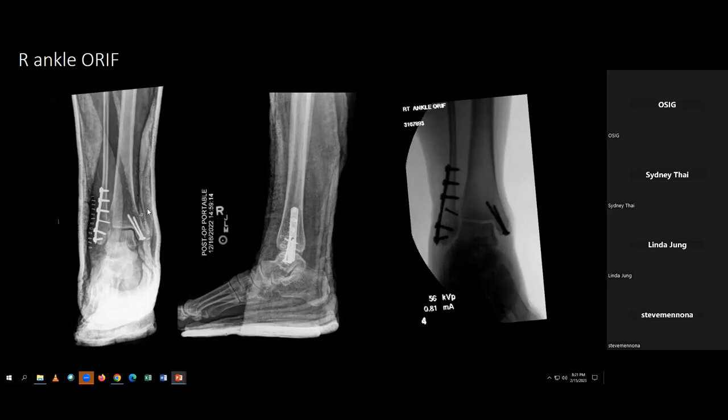And on the medial side, why can't you just do one screw there? Well, common sense will tell you if you have a free floating bone and you just put one screw through it, it'll rotate, right? So you put 2 screws to prevent rotation. And yeah, that's stable. The lag screw that you use laterally, you mean like partially threaded?